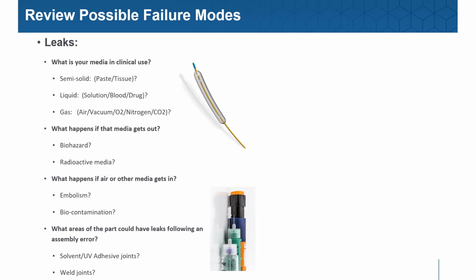So those are some of the extreme situations where tracer gas would actually be required. How many are actually using tracer gas? I honestly can't think of any. This has been a proven successful application. However, the customer is making these trach tubes because they're used so often. Look at the cost of the consumption of the tracer gas media and the cost of the equipment, which typically, the price tag starts at around 150,000 US dollars for a turnkey system that is tracer gas capable of measuring a trach tube balloon.